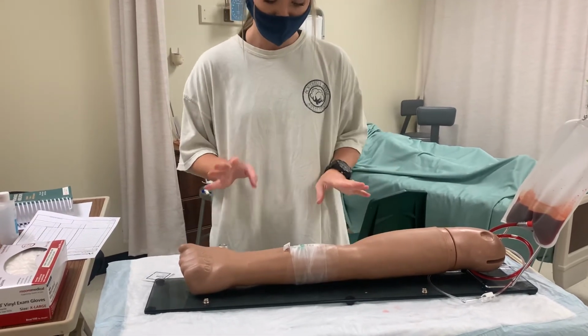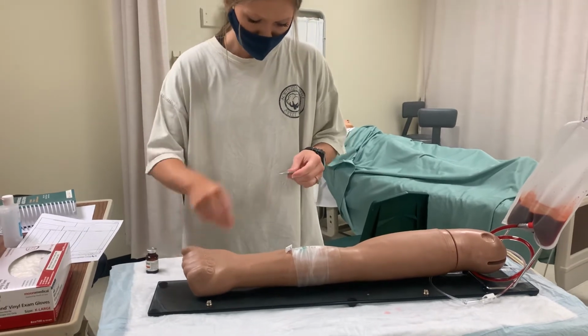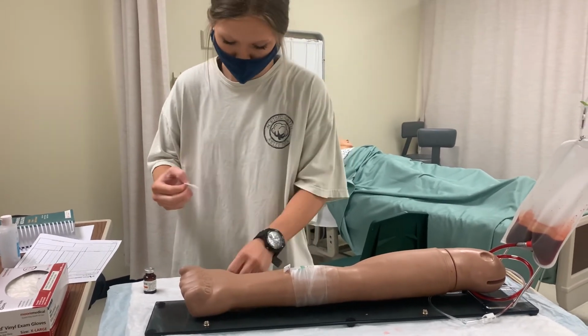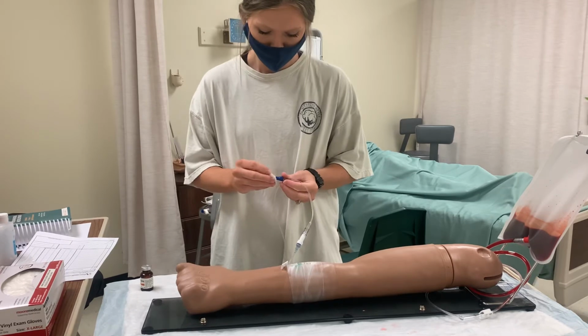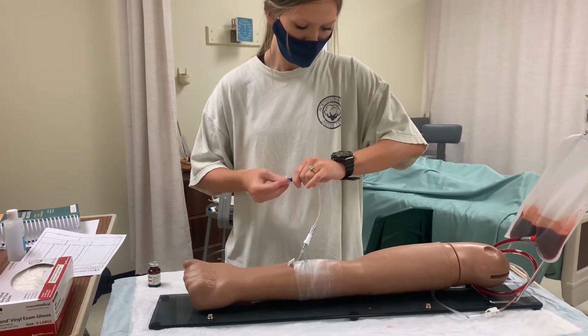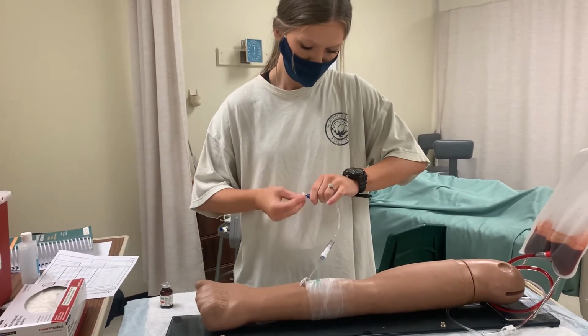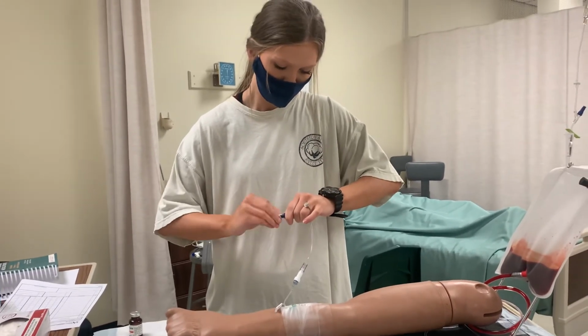Since it's not in an IV, we don't have to wear gloves. So I'm going to clean the port closest to his IV for 30 seconds. I'm giving 1 mL every minute, so I'm going to be clamping the tubing closest to the bag.